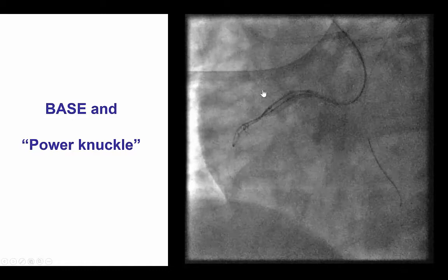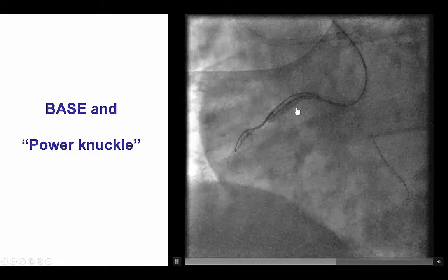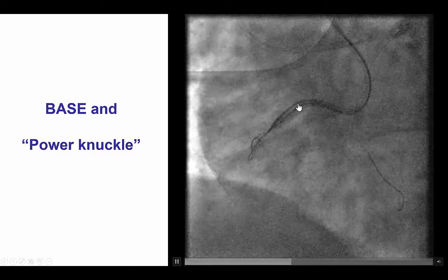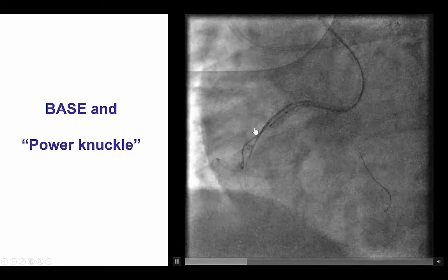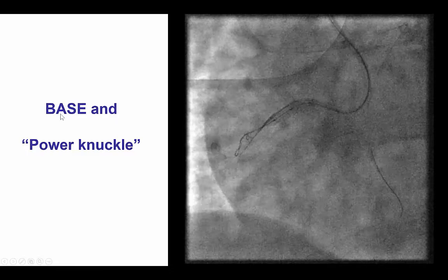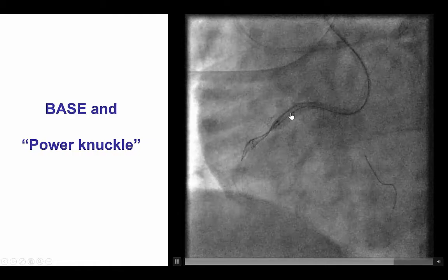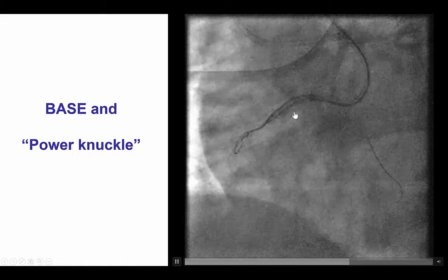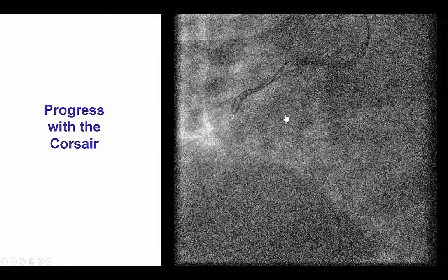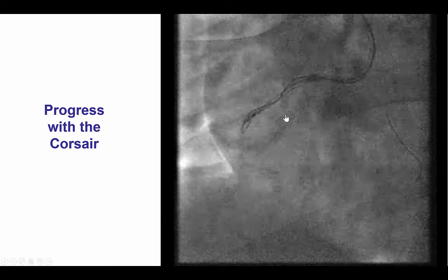Instead, we did the BASE technique in which we inflated a large balloon in the proximal right coronary artery right next to the Corsair microcatheter, and then advanced a polymer-jacketed wire in a knuckle fashion subintimally into the mid-right coronary artery. This is an example of BASE, or balloon-assisted subintimal entry, in which the balloon creates a dissection through which there is advancement of the subintimal guide wire, supported by the strong compression of the microcatheter from the balloon.